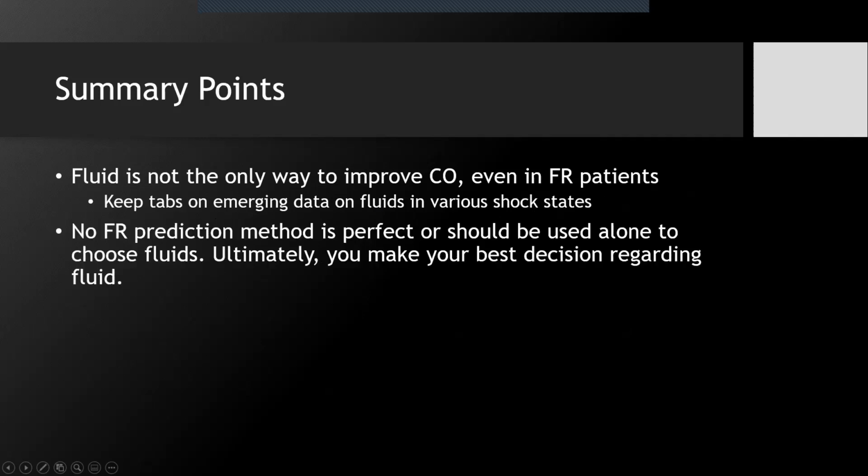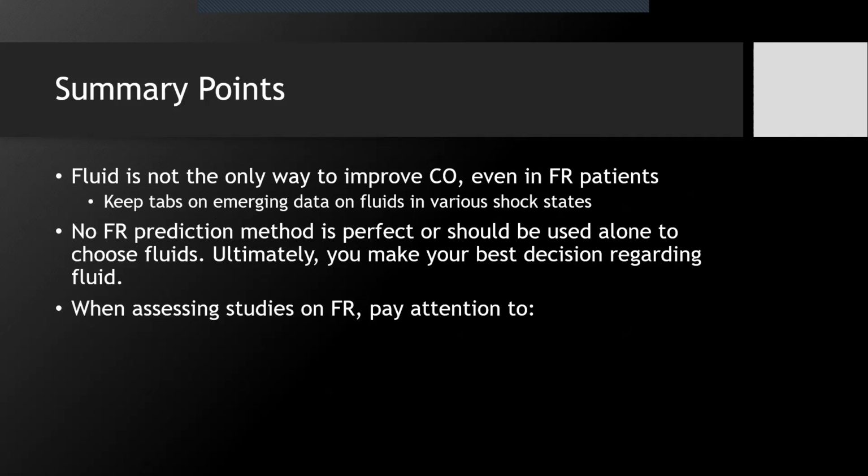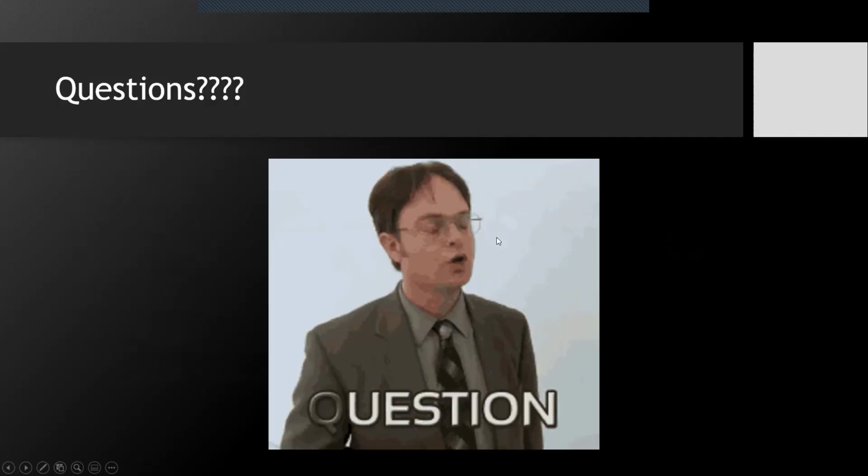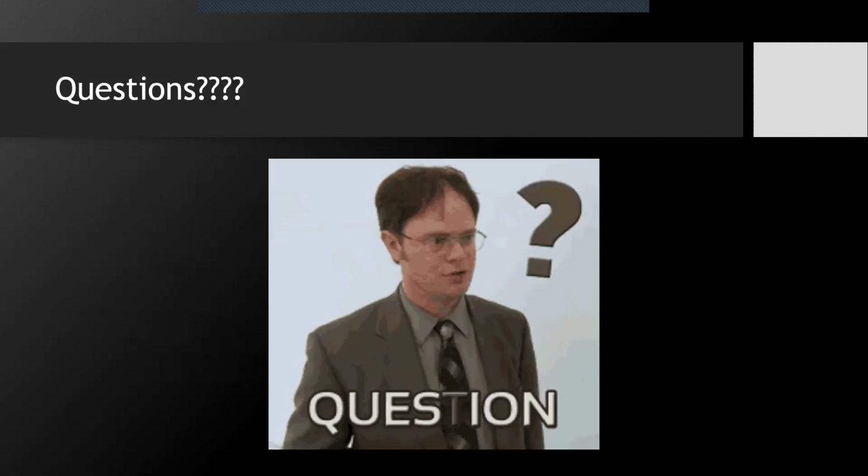There's no fluid responsiveness prediction method that's perfect or that should be used alone. Ultimately, you have to make your best decision. And when you're assessing studies on fluid responsiveness, make sure that you know the study population and make sure you know what combination of fluid stimulation and cardiac output read has been employed. And happy to take any questions.